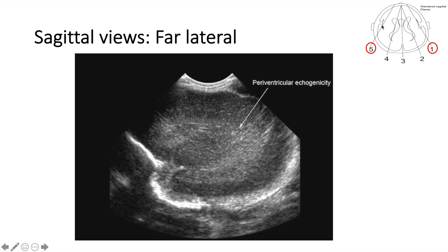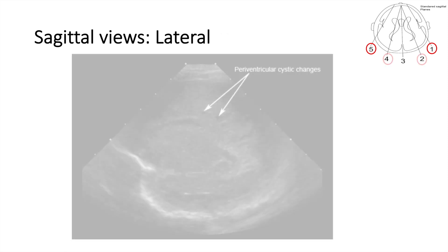This is more lateral to the previous view — we're cutting through the white matter. It's a very important view because sometimes we can see periventricular echogenicity, which may mean something in preterm infants, may mean nothing, or it could be the start of PVL (periventricular leukomalacia).